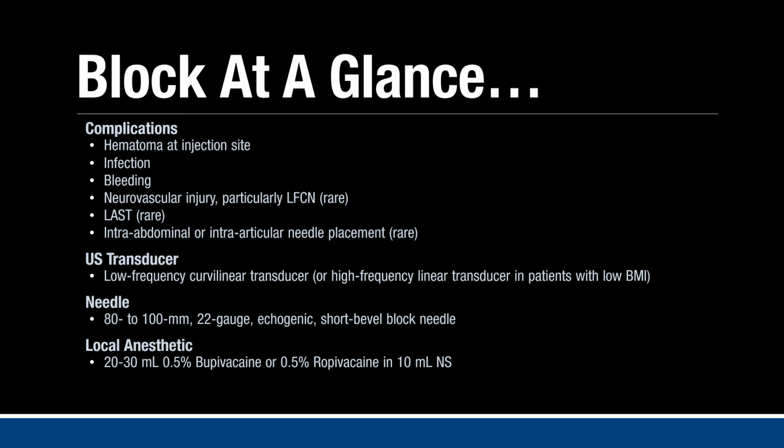technique. For the PENG block, the provider should utilize the high-frequency linear probe in low BMI patients, but generally speaking, the low-frequency curvilinear probe is going to be required due to the depth of the injection target, especially in large BMI patients with a plethora of subcutaneous tissue.